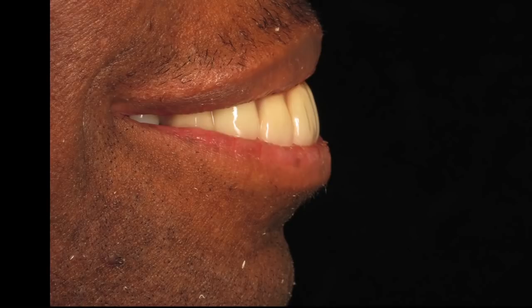Following extraction of those anterior teeth, we provided him an immediate provisional partial denture, which is in the picture right now.